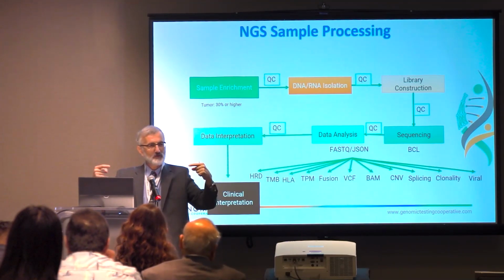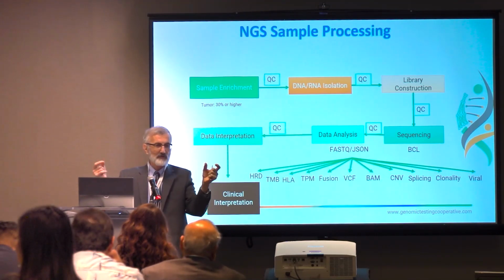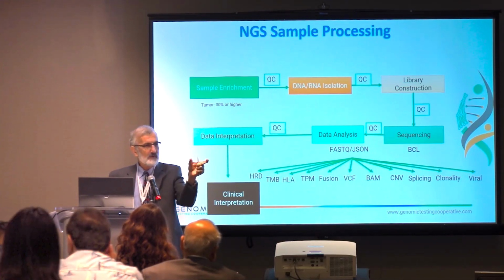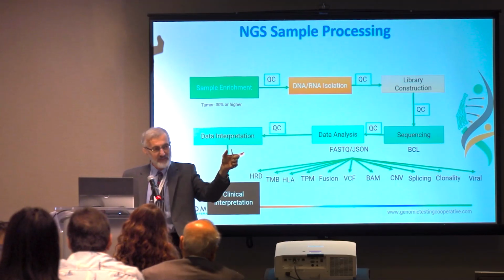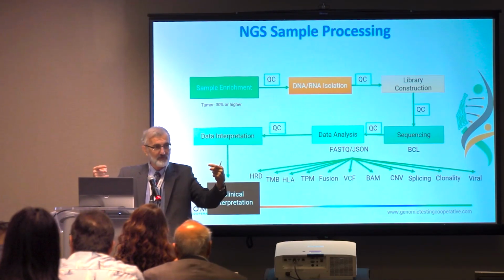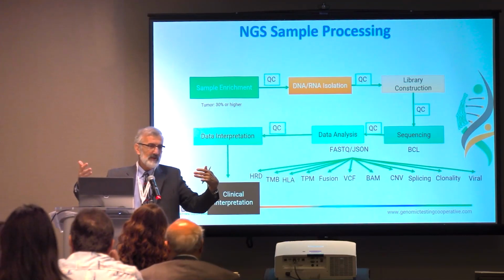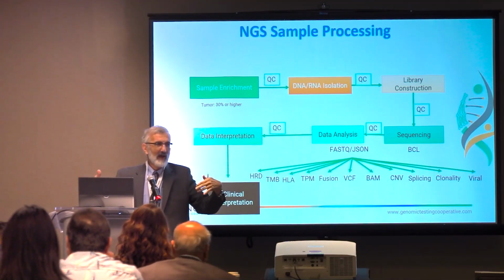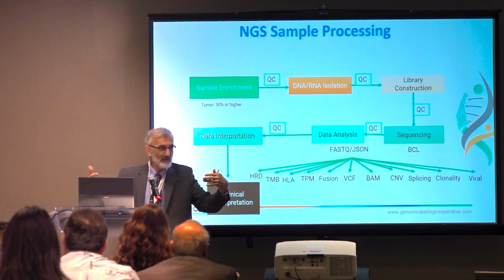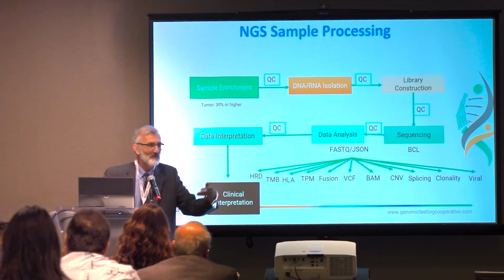And it is not unusual that the data, especially with hybrid capture or any sequencing, all it takes is maybe 10 nucleotides from the other genes to match. The software will tell you that this is a translocation, and it is not necessarily a translocation. There are some we see in normal individuals, and some of these have been published in papers as if they are translocations, and definitely they are not translocations. We see them all the time.